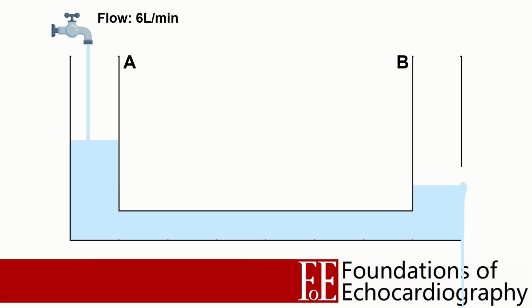Now the flow in and out of the system is equal, and there is a constant pressure gradient between the two tanks. Now if the pipe offers a constant resistance to flow, then if we double the flow into tank A, we will see our pressure gradient rise to double. And if we halve our flow into the system, then we lose excess volume until the pressure gradient halves.